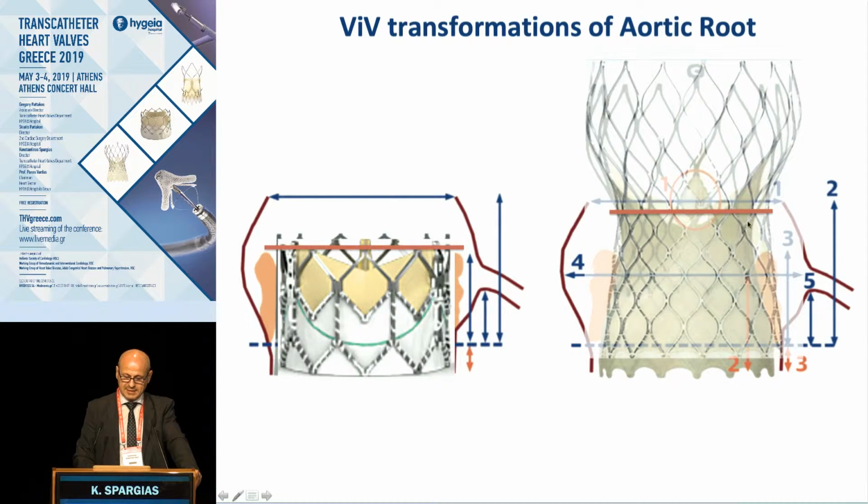When you implant a second Medtronic valve in another Medtronic valve, you have to move a little higher, but the leaflets of the first Medtronic valve, because it's supra-annular, are really higher. So the new cage that is created and isolating the leaflets of the latest valve from the forces outside is going really higher. So in the first case, when we have valve-in-valve with a SAPIEN, within a SAPIEN or within a core valve, nothing happens.